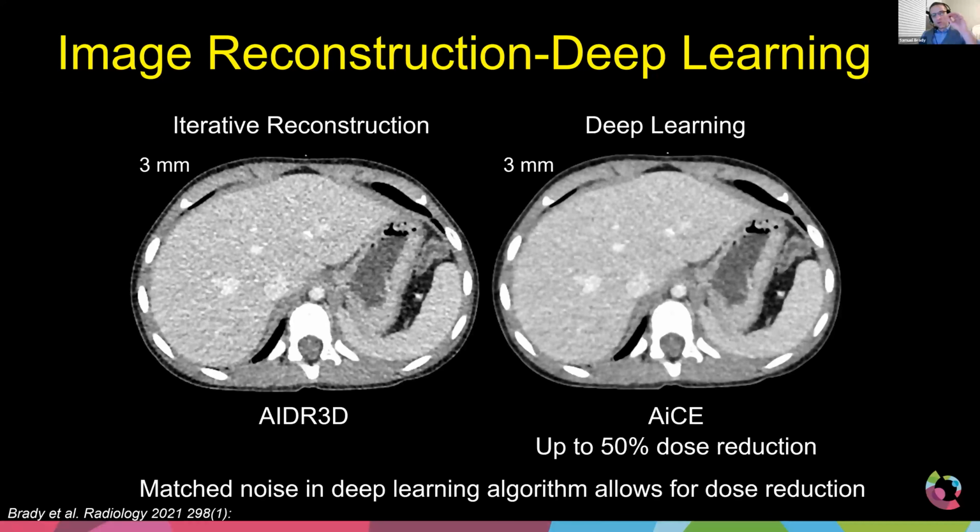But like Tanya said, what if we do want to keep moving that dose needle down? Yes, we have a lot of flexibility now. So here I took this patient, I actually didn't change the dose. This is just pure computer calculations. What if I take this patient that is currently getting imaged at a 3 millimeter thick image. It's got a CTDI value that creates an image quality that looks like this. And let's just say our radiologists, they've been looking at these noisy images so long that they're okay with it. Okay, that's fine. I'm going to do my best to match that noise output.